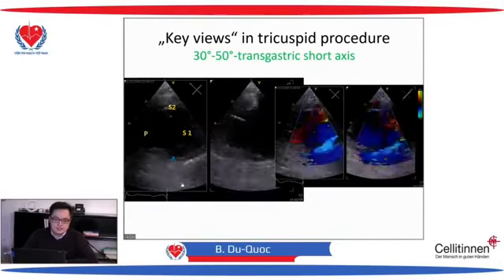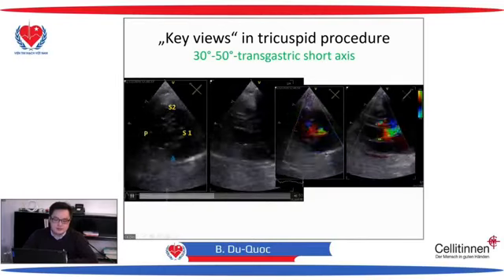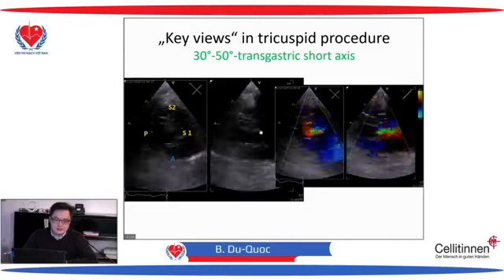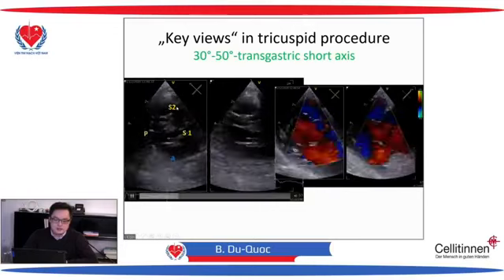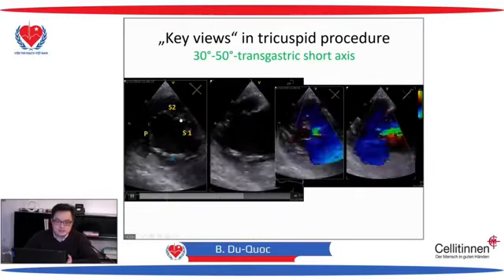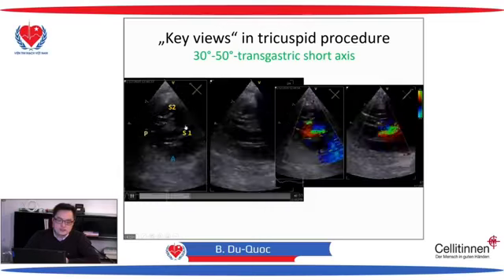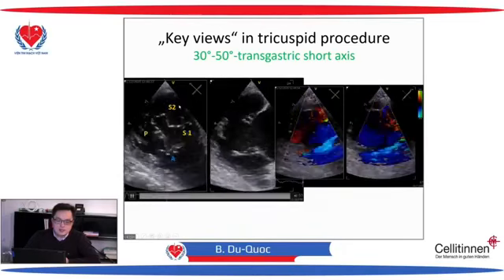Now, here you can see that the tricuspid valve does not have 3 leaflets, 3 cusps. There is a classification, Septal 1, Septal 2. This is very controversial. If you ask 3 cardiologists, one says that this is septal, maybe posterior. But I talked with some colleagues, and we are of the opinion that this is S1 and this is S2.